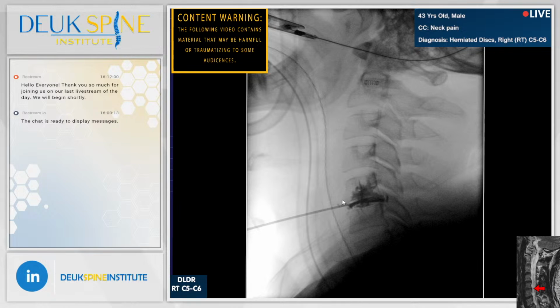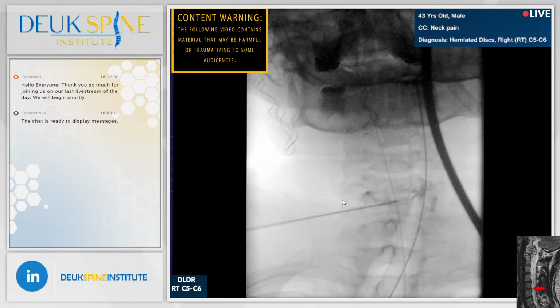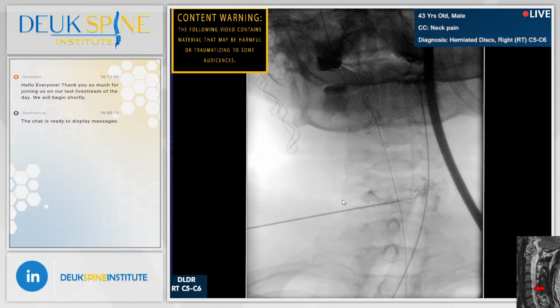We'll get an AP, and you're going to see the dye leaking out into both foramen. That's where his pain's coming from, folks. He has an annular tear. One more time. It's a little blurry. Perfect. Look at the tear. Wow. Both sides. And the dye leaking out the back of the disc through a gigantic tear running from one side to the other. That's what we're here to fix today, folks. We're going to get rid of the herniation, and we're going to clean out that tear.